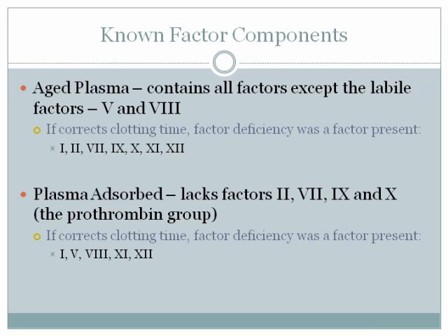All right, so this patient had a normal pro time and a prolonged APTT. When they mixed it with serum, it corrected. When they mixed it with aged, it corrected. And when they mixed it with adsorbed, it corrected. So the first thing that you should do, just by looking at your PT and APTT results, is determine what factors here are choices.